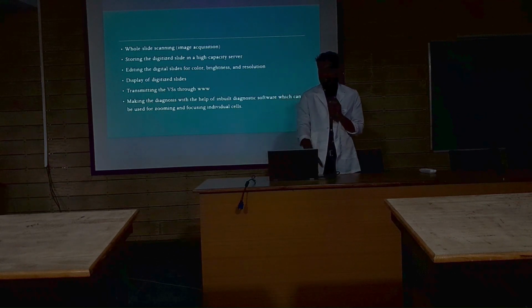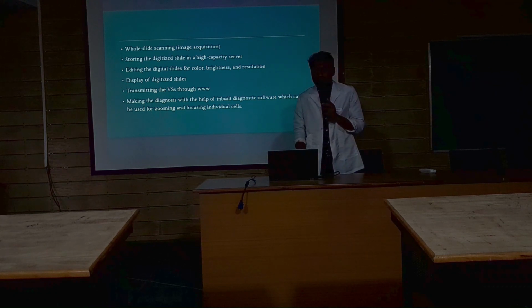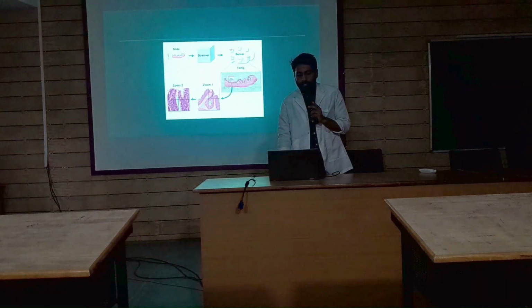So the process, as I said earlier, is whole slide scanning. Then we store the digitized slide in a high capacity server. Then we edit the digital slide for color, brightness and resolution, and display the digitized slide. Then we make the diagnosis with the help of inbuilt diagnostic software, which can be used for zooming and focusing on individual cells.